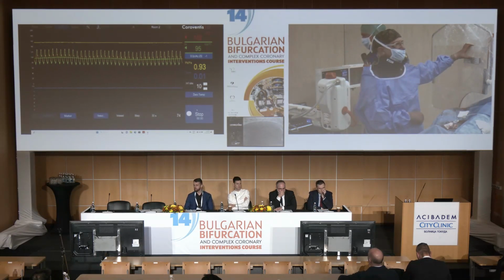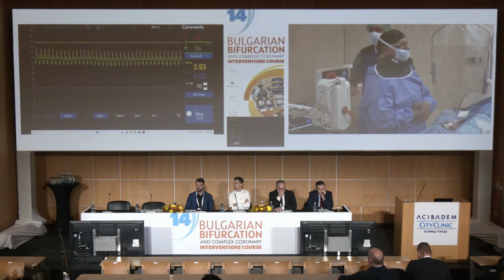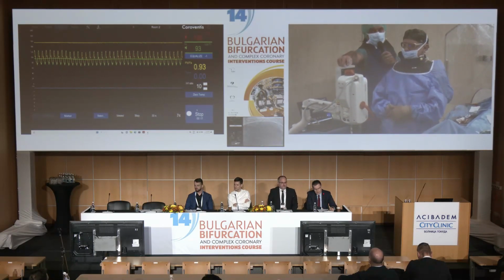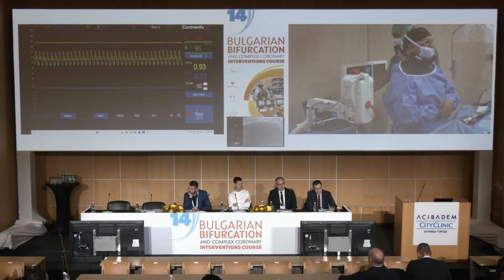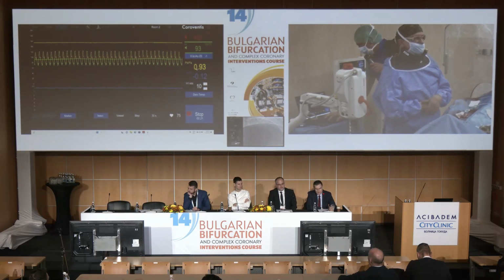I record, and now I ask Tabo to push the button and to start the pump. You can see that the pump is now delivering saline at 10 milliliters per minute. Please keep your foot on the scopy. And then you will see that the numbers here are going down.